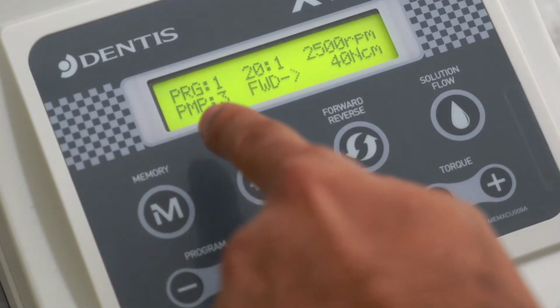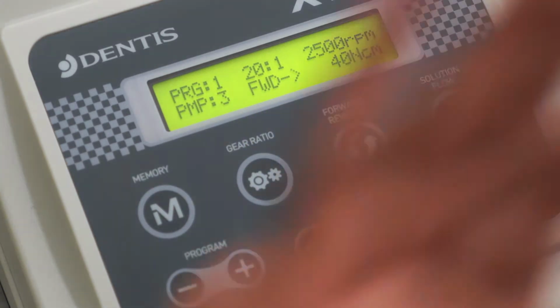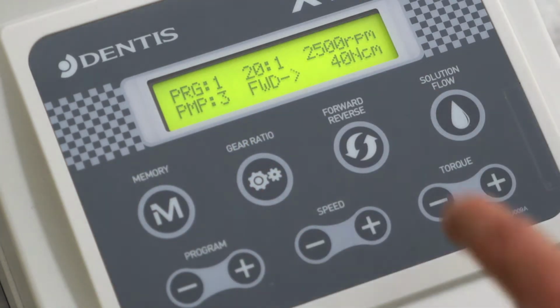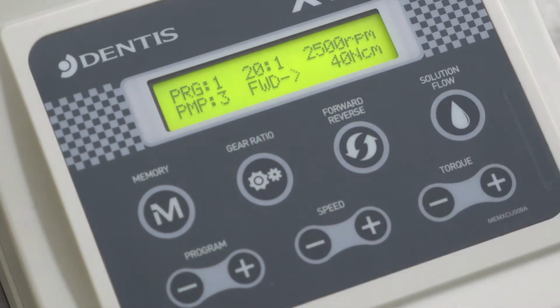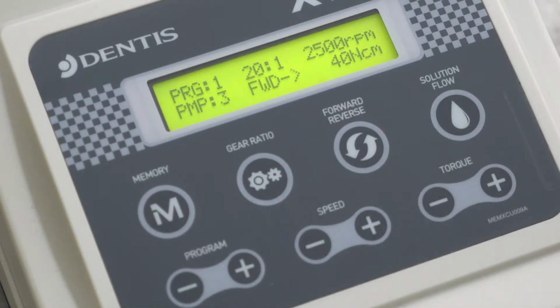So underneath program, we have PMP, which stands for pump. That's how much irrigation you're getting through. The 20:1 is the gear ratio, and that corresponds to the gear ratio on your handpiece. And this one, it's a contra-angle, it's a 20:1. Below it is the direction. You can have forward or reverse, obviously forward for osteotomy.